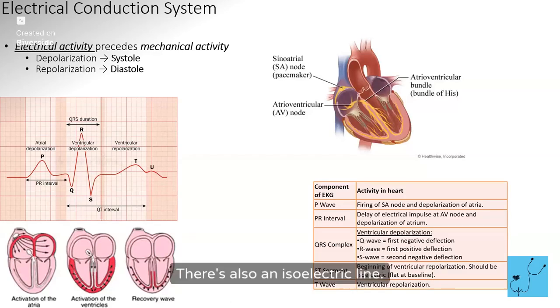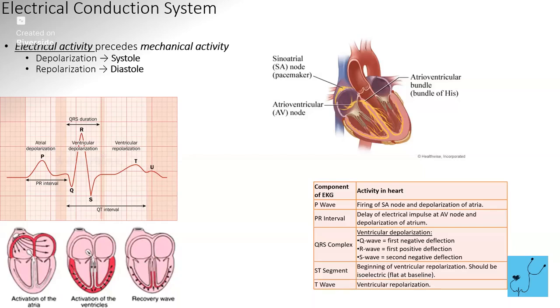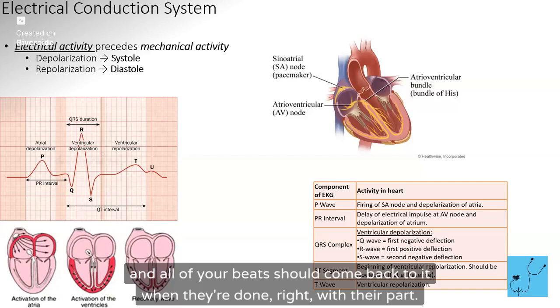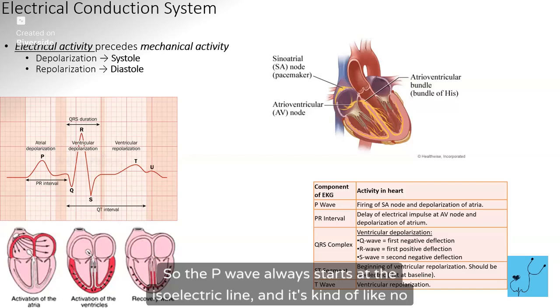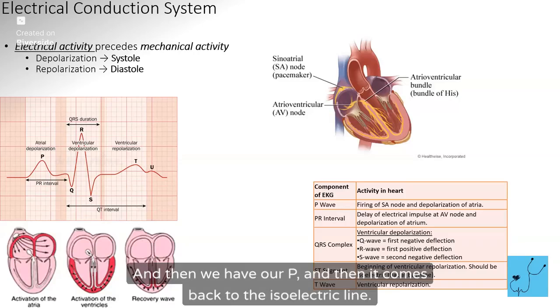There's also an isoelectric line, so you should be able to draw a line on any of our papers, and all of your beats should come back to it when they're done with their part. So the P wave always starts at the isoelectric line, and that's kind of like no electricity. And then we have our P, and then it comes back to the isoelectric line.